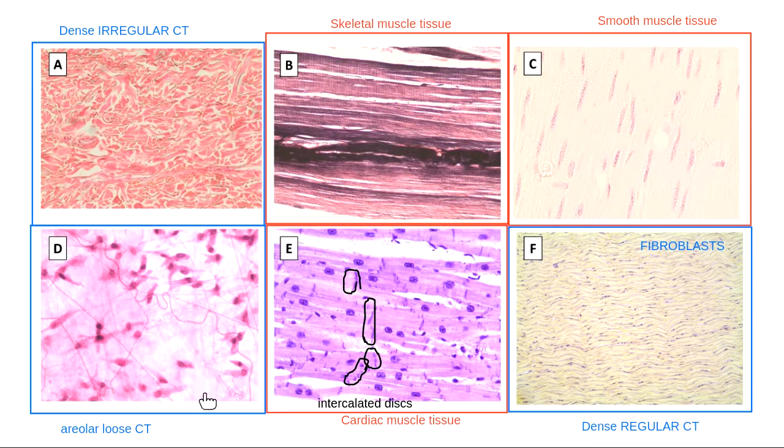So we've got a loose connective tissue, and in between my cells, these dark spots that I see here, I have a lot of different kinds of proteins. So notice I've got some of these crisscrossing lines or this fun little squiggly one that I see right here.